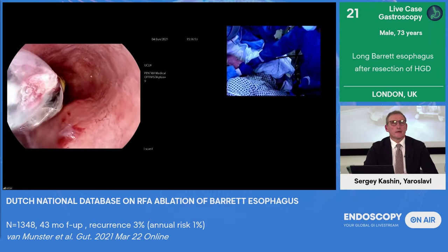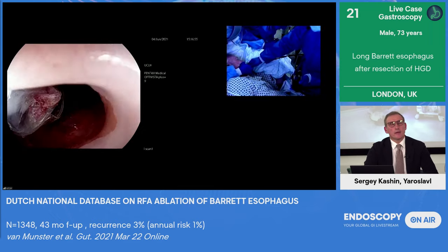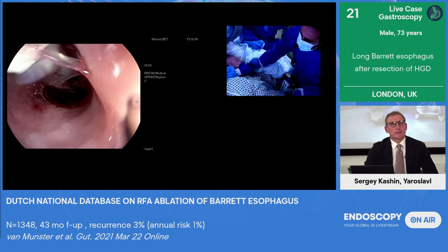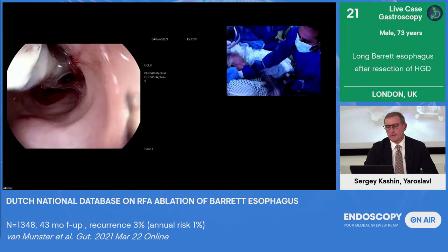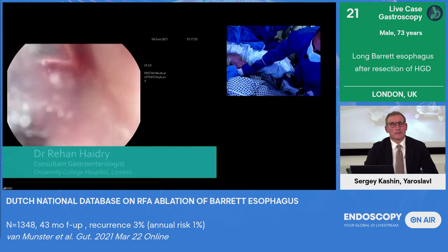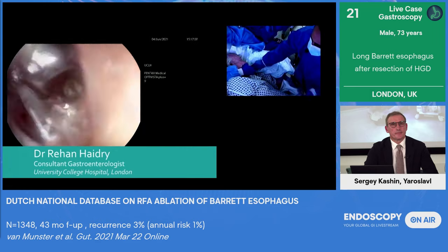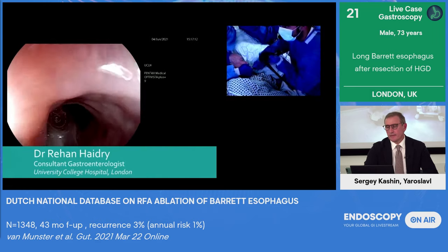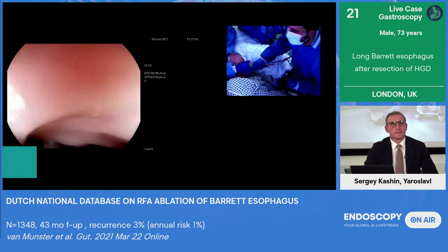Great. So Rehan, how many RFA sessions do we need for such a long segment of Barrett's? A lot. From our data previously, we had a median length of 6 centimeters, and they needed about 3 to 4 sessions. In Vinay's hands, he'll probably do this in 2 sessions, but this guy will probably need about 5 sessions of therapy.